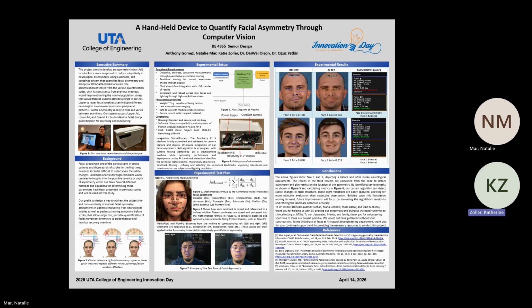Okay, so for our experimental setup, we have a couple of requirements here on the left. We have our functional and physical requirements and our constraints. The functional requirements are basically how we want our device to function. So objective, accurate and reliable, able to integrate well into clinical workflow, and give us consistent results across a bunch of different skin types and lighting conditions.